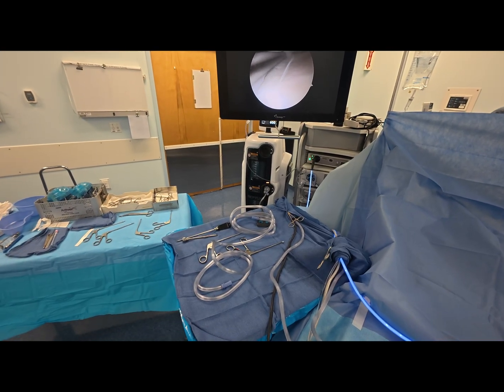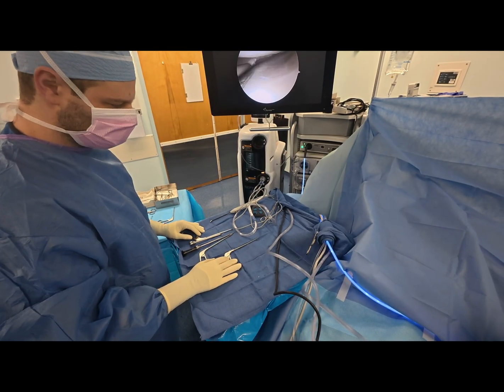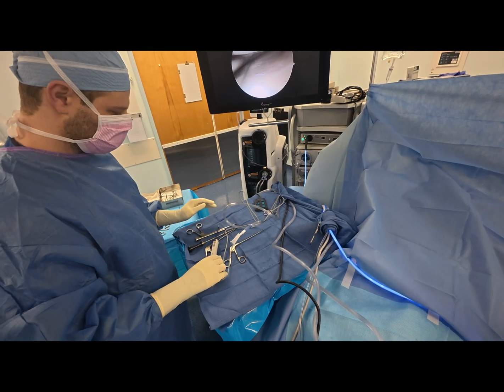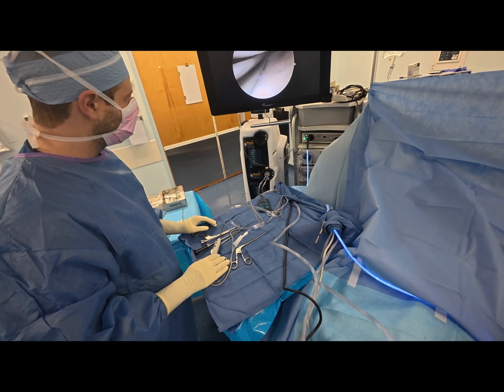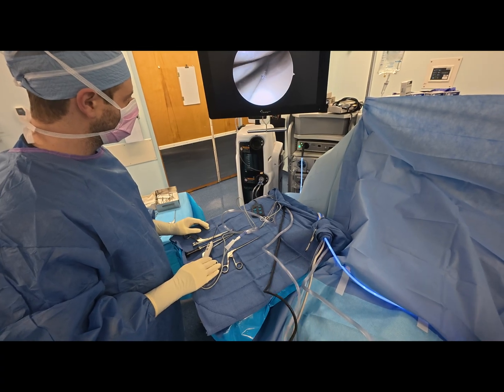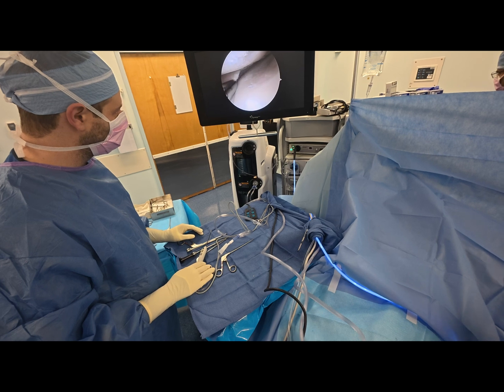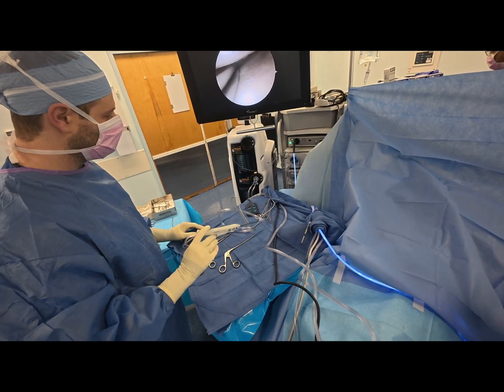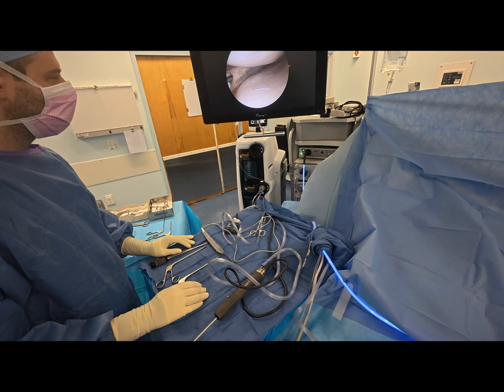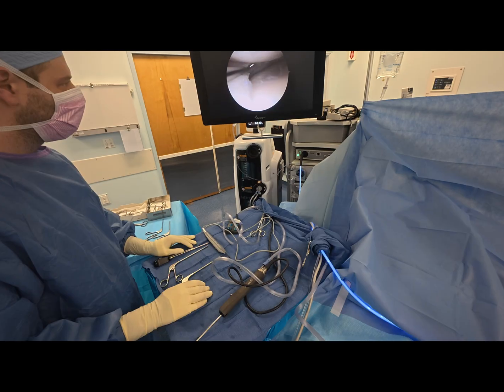That's his problem. In the office, when patients are diagnosed with meniscus tears, I always give the analogy of sort of a hangnail. We're doing the arthroscopic procedure not to remove the whole meniscus, but just the part of the meniscus that's torn, very much akin to a hangnail, where you take a nail clipper and you just clip the part of the nail that's torn so the whole nail doesn't rip off. Okay, so here we're done. You can see we did the partial meniscectomy. We removed just that hangnail.